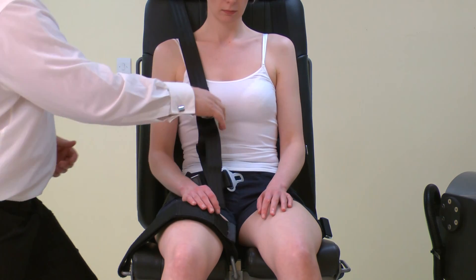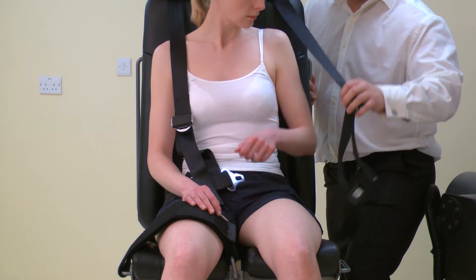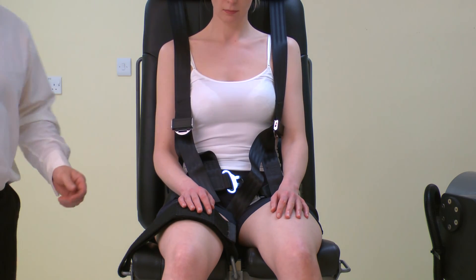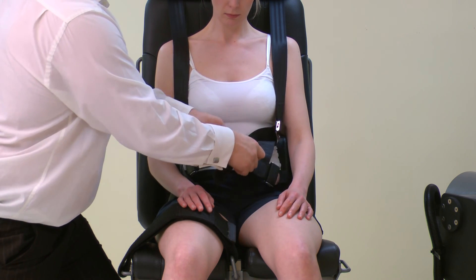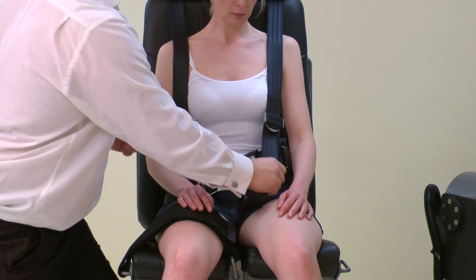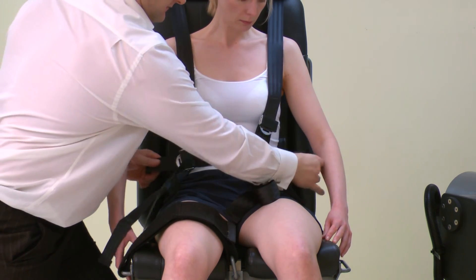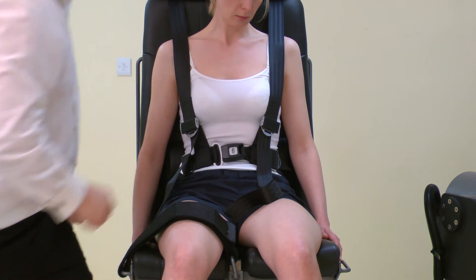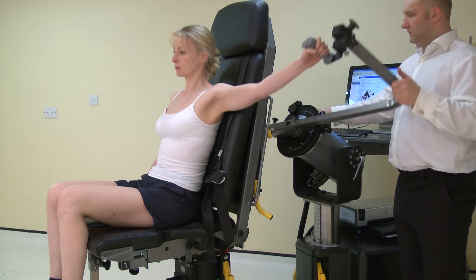Finally, attach the shoulder straps if required. To use the chest straps, first place both arms through the loops, then clip the straps together using the clasp. Tighten the upper straps until the waist sections are above belt level. Now tighten the waist straps, keeping the clasp centrally on the waist. The test is ready to begin.